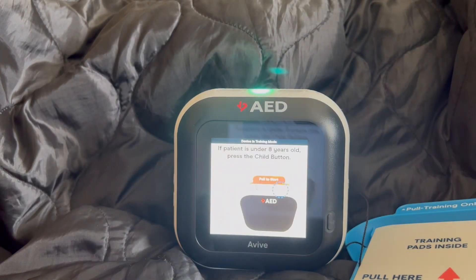Powered on. If the patient is under 8 years old, you must press the child button on the top of the device.